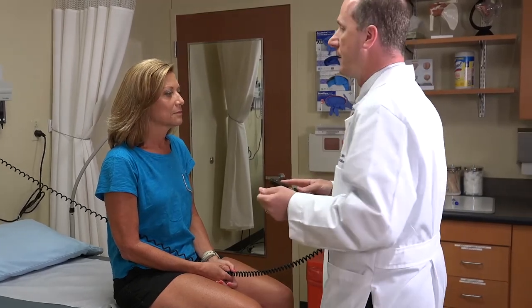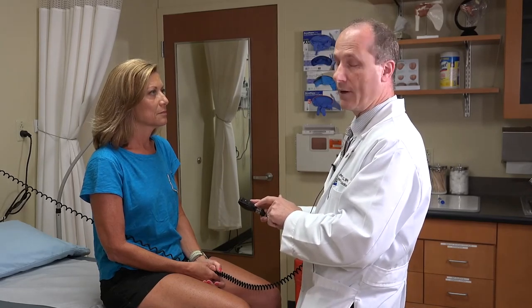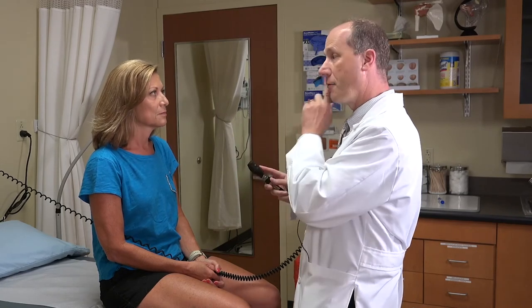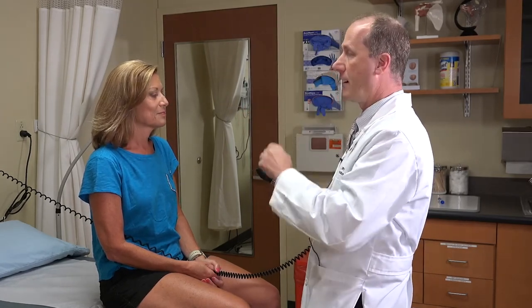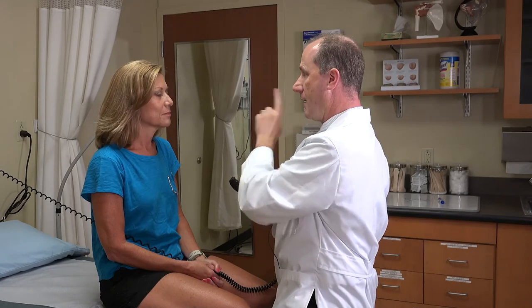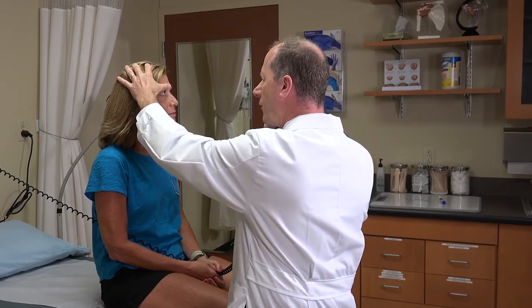So we're now back with the patient. You want to make sure that you have your positioning done. I'm on a white zero, which is basically where my home base is — remember what your home base was for your particular eye. You want to make sure you're going right eye to right eye. If you go right eye to left eye, you're going to end up nose to nose with the patient, which is a little bit uncomfortable. I like to put my thumb on their eyebrow.